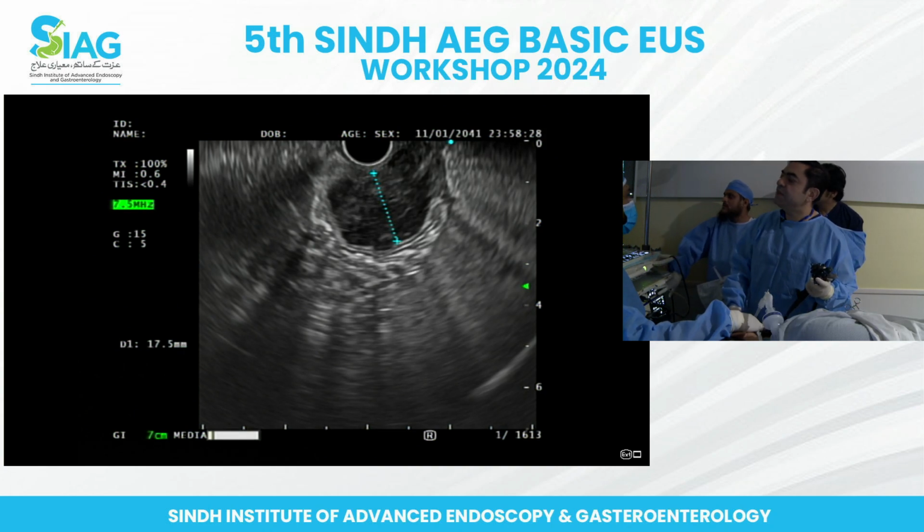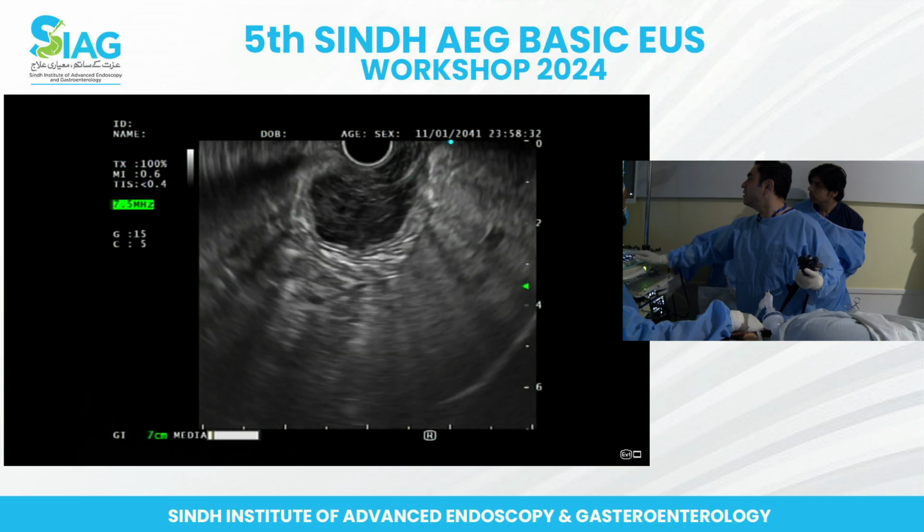So 17 millimeters, so 1.7. Okay, and then under side, yeah.